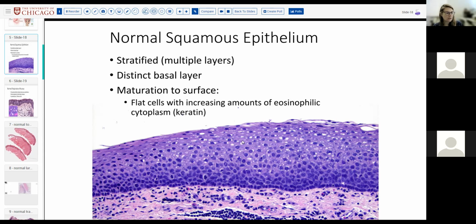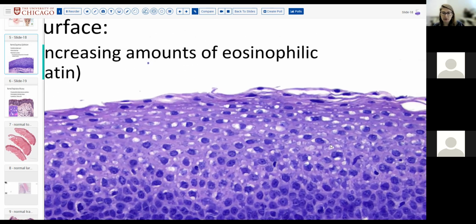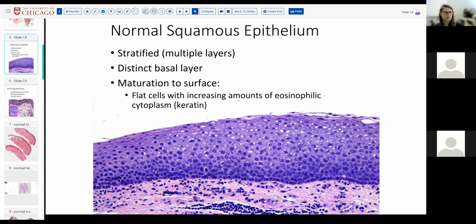That's glycogen. So don't be necessarily thinking that all of these are like coilocytes, for example, that are HPV type of change. You have normal glycogenation of the perinuclear area in squamous cells. And when we talk about our mucicarmine or our PAS staining, we will talk about how glycogen functions with PAS. So yeah, excellent. Do you want me to do that now? I don't have a slide in here, but I could. Who wants me to talk about diastase and glycogen?